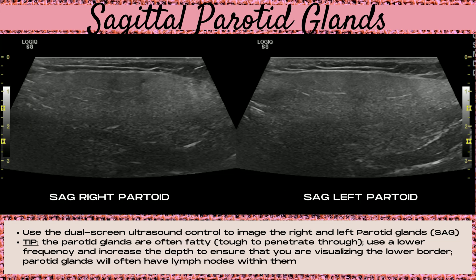Next, move on to the sagittal parotid glands, found in front of the ear and just slightly inferior. Use the dual screen control to image the right parotid on one side and the left on the other. The parotid gland is best imaged in the sagittal plane. Pro tip: parotid glands are often quite fatty — almost like a fatty liver on ultrasound — making it tough for sound waves to penetrate. In these cases, use a lower frequency, increase the depth to visualize the lower borders, and increase the far-field TGC. It's also very common to see lymph nodes within the parotid glands, appearing as oval to circular structures with a hypoechoic outer rim and a hyperechoic central fatty hilum.